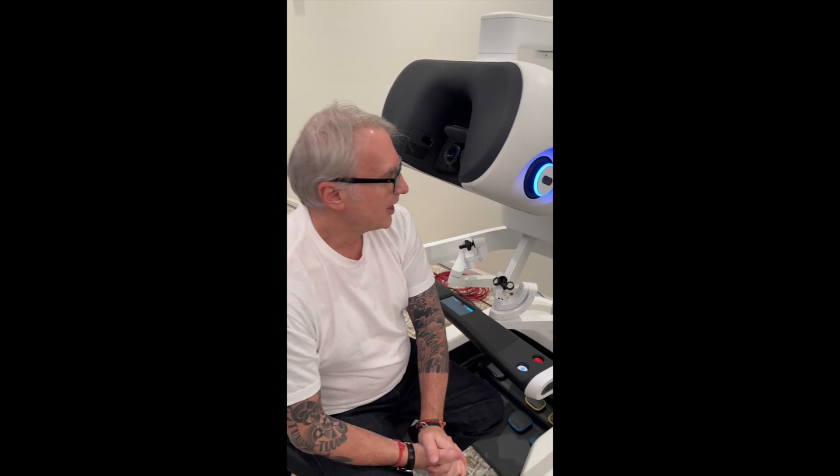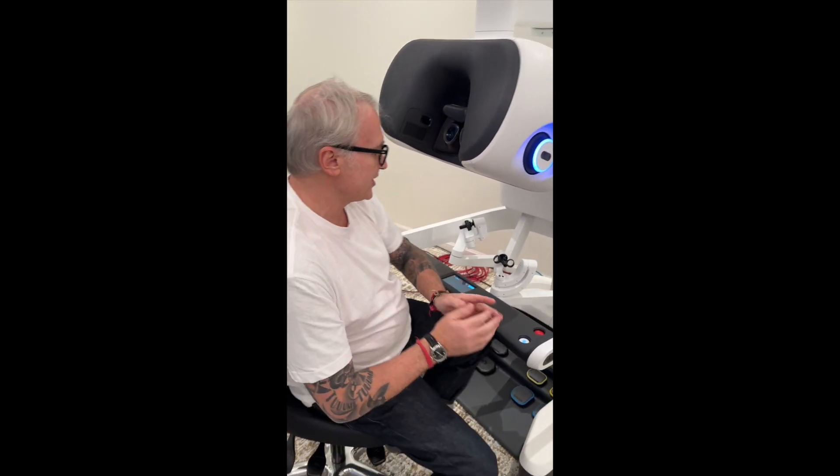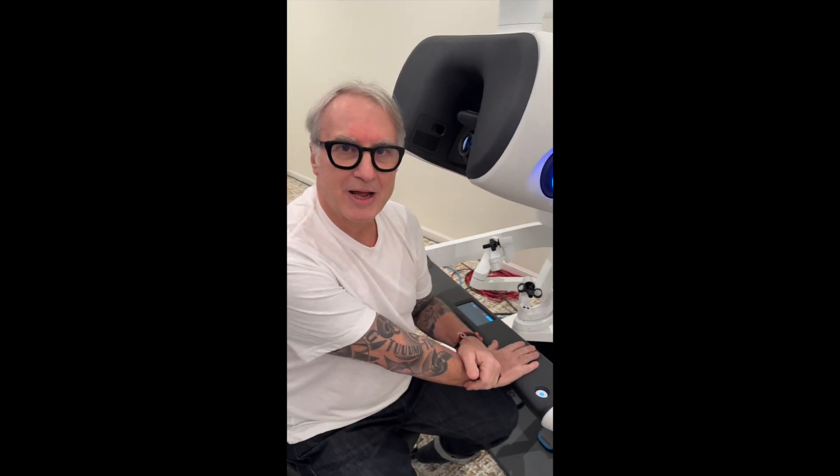Let me show you something I think is very interesting — how this thing works. One of the observations people had about robotic surgery was the fact that there wasn't any haptic feedback, and now this robot does have that, on top of many other things I'm going to be showing you.